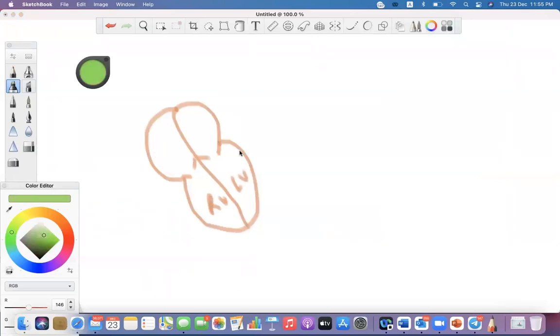When the muscle of the left ventricle becomes hypertrophied, like this, its electricity will increase. So this is the electrical direction of left ventricular hypertrophy.